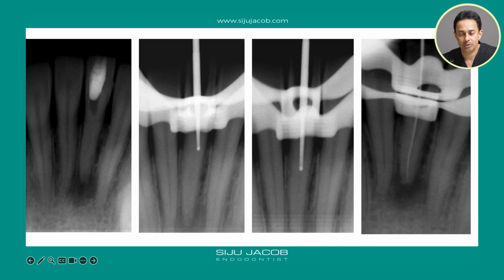How do we use CBCT as a tool to locate calcified canals? I'm going to show you some cases which I did in my own clinical practice, and that will give you a clue as to how to use this when you come across similar situations in your own private practice. So this was a case where a clinician had already started the case, went around looking for the canal, couldn't locate the canal, and referred the case to me. You see the earlier direction is towards this side. So we reorient the burr along the long axis of the tooth, and that helped us get back on track, and then we located the canal.